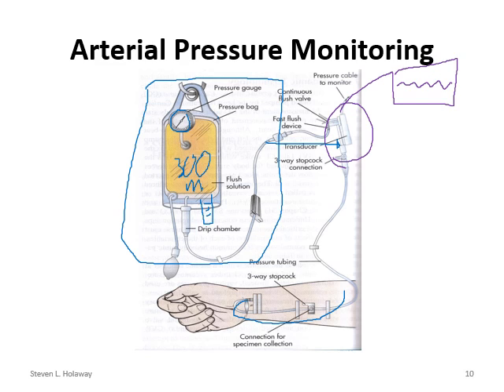With transducers, we have to level them, we have to zero them, and when we set them up, we have to make sure there's no air in the lines. Now, you may hear some people talk about a pigtail. Most of the transducers have some sort of device where you can open it up and allow fluid to flow freely from the bag into the site here. That normally occurs if we have to draw blood or if we need to flush blood back through the system. So you may hear someone talk about a pigtail.